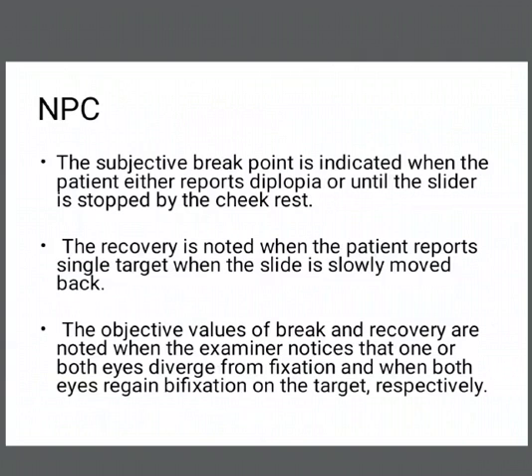Near point of convergence is recorded as breakpoint and recovery point, subjectively as well as objectively. The subjective breakpoint is indicated when the patient either reports diplopia or until the slider is stopped by the cheek rest. The recovery point is noted when the patient reports a single target when the slider slowly moves back.